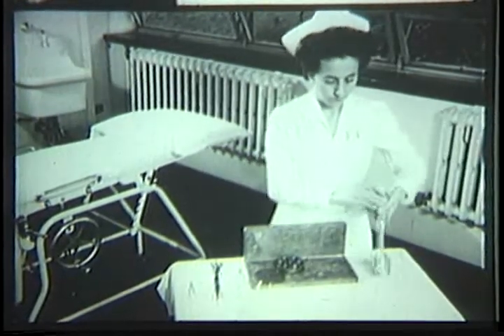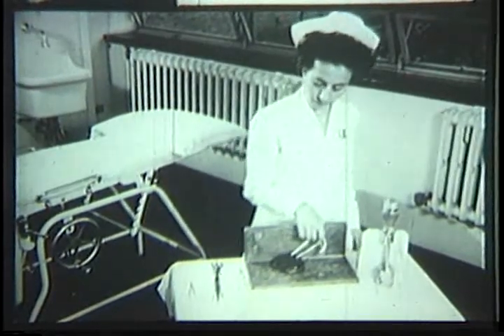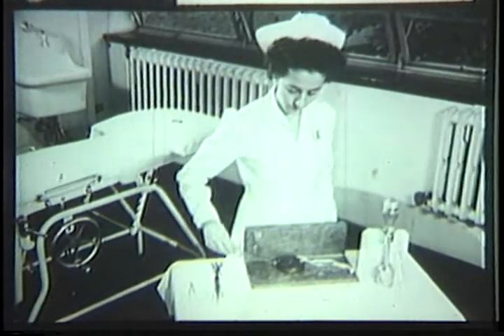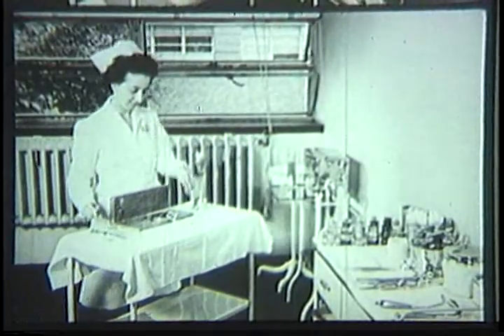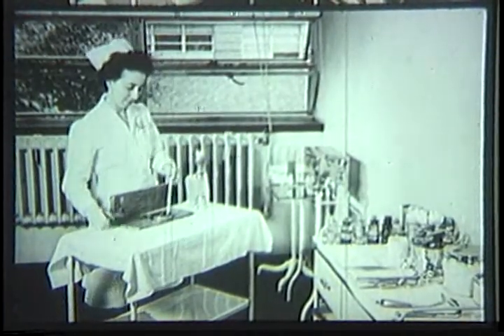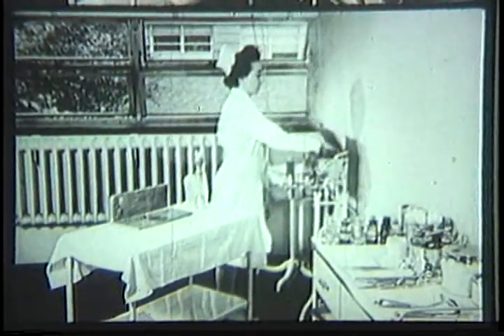Notice how the nurse carefully avoids exposure to the radon seeds. She handles them with long forceps behind a lead shield, while putting them in a special lead container for sterilizing. Both the needles and the container are placed in the sterilizer.